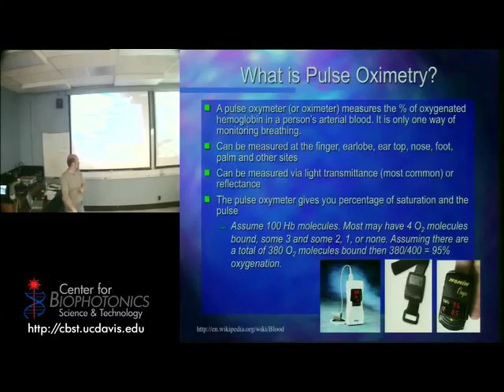Yes, Bo? What's the ideal saturation of 100%. Yeah. Some of you had that. I unfortunately do not. I'm more like 97, 98. It tends to be that as you get older, that percentage tends to go down. Now, if you're quite the athlete and are constantly exercising and being very active, chances are it's going to be higher. Okay? But when you're young, chances are that it's going to be high as well, unless other activities that you engage in might cause problems in the oxygenation of your blood, or you just don't have that efficient of a system. Yeah, there you go.